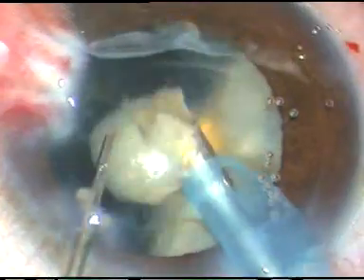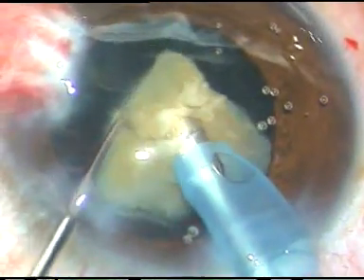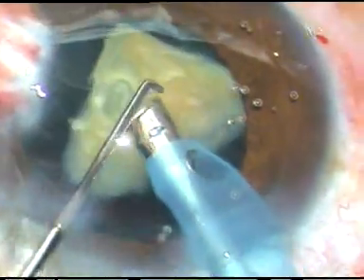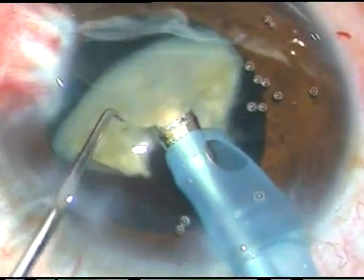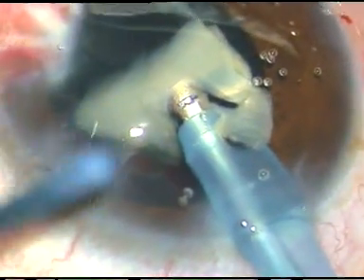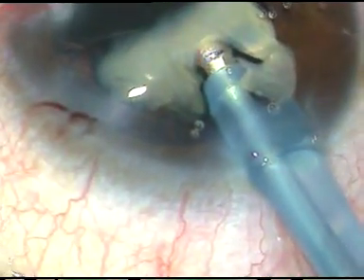Nucleus of this hardness needs phaco power of about 65% in Oertli's Cataris 3 phaco machine. This is the last nuclear fragment — it is being eaten up partially, and now I'm going to use the PCP Posterior Capsule Protector. I remain in this position and now I place the PCP under this nuclear fragment and over the posterior capsule.